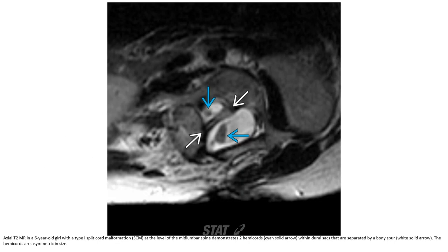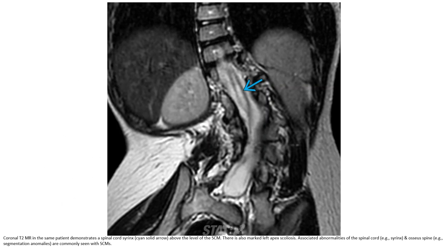This is a case of a 6-year-old girl with type 1 split-cord malformation at the level of the mid-lumbar spine. The patient demonstrates two hemichords within dural sacs that are separated by a bony spur. The hemichords have symmetric appearance. This is the T2 MRI.